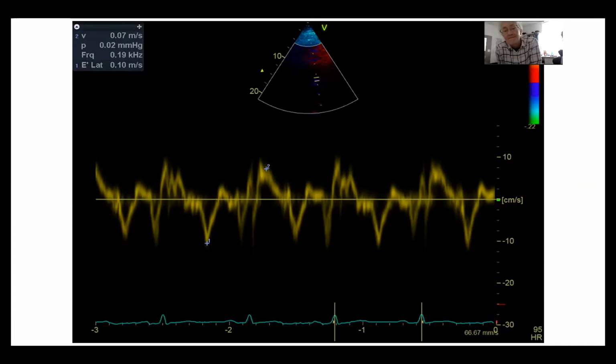I'm not so entirely sure whether that persuades me in any meaningful way. I mean, but you have an abnormal septal motion here. I'm not so sure. The bigger question, it seems like, so you're showing us some features of tamponade, but on the other hand, it needs to be a clinical interpretation of the whole case.